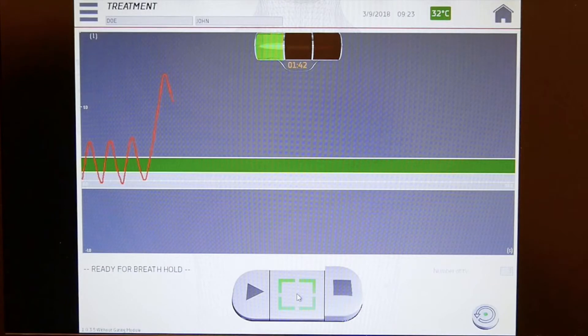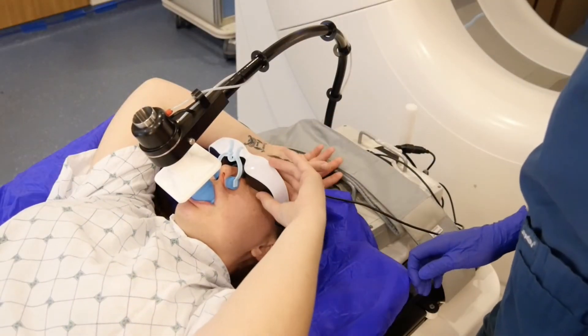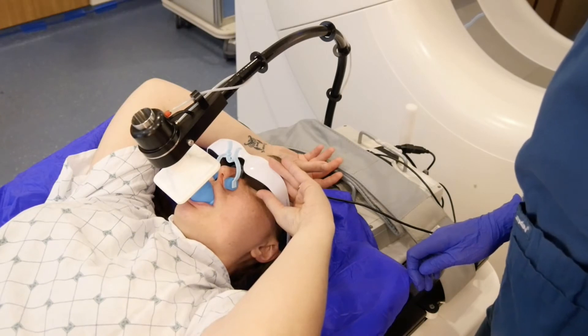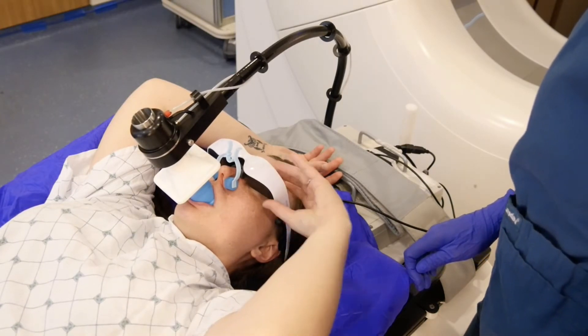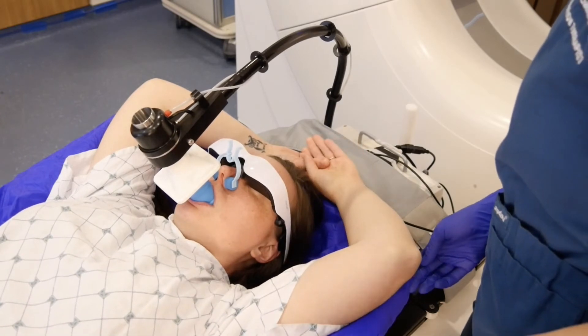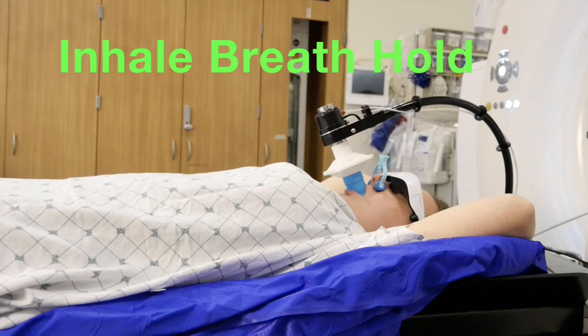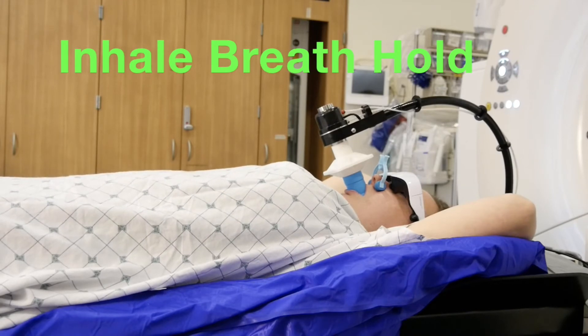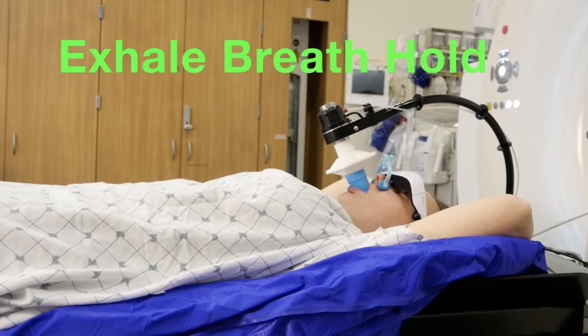What you see through the goggles is exactly what the therapist sees as they monitor your breathing. After you are comfortable with these pieces of equipment, the therapist will connect your mouthpiece to the SDX system. You will remain in complete control of your breathing during the entire process. If the treatment area is in your chest, you will hold your breath after inhaling. If the treatment area is in your abdomen, you will hold your breath after exhaling.